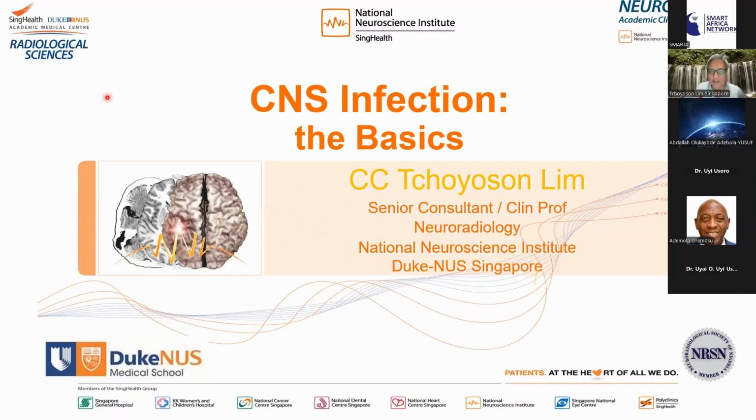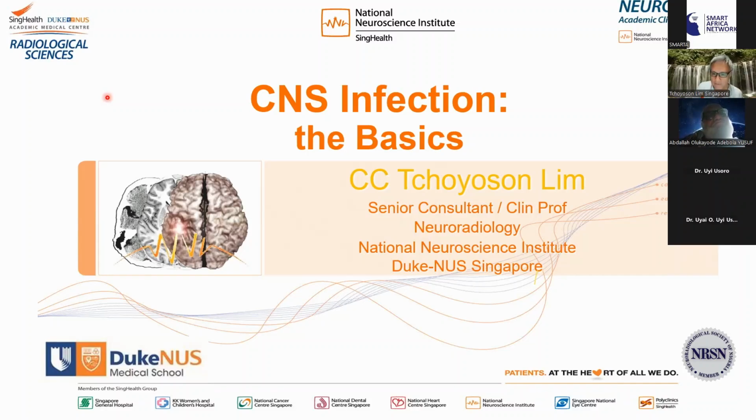This is a presentation that I've prepared for senior residency training and for junior faculty who are specializing in neuroradiology. I work in a neuroscience institute and we specialize in all neuro all the time. So we have CT and MR. We spend a lot of our time with difficult cases on MRI.